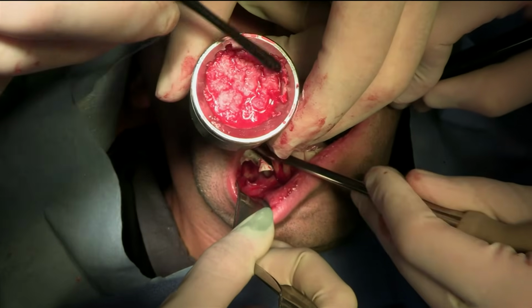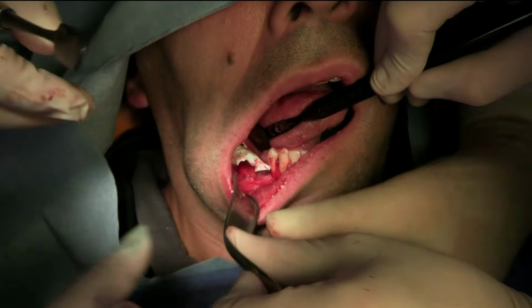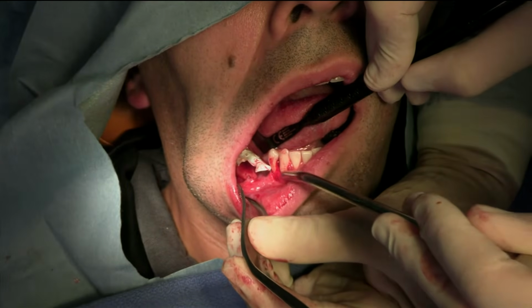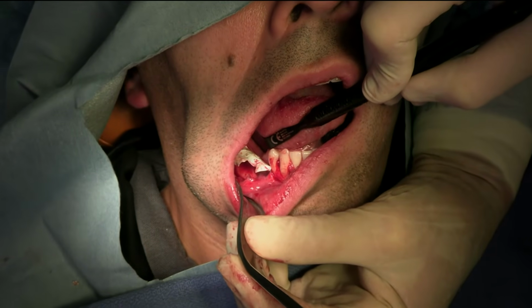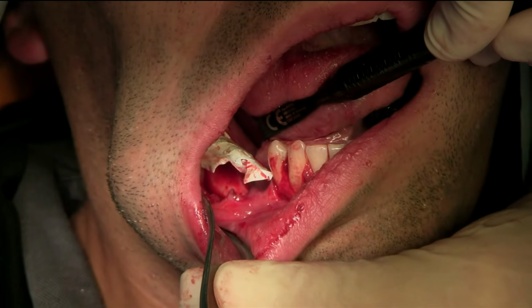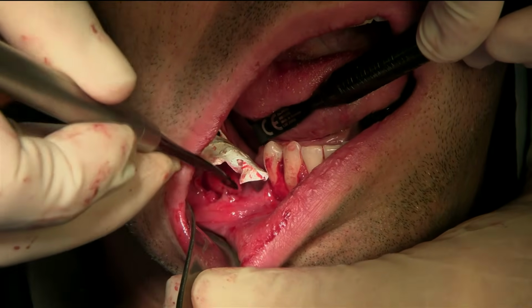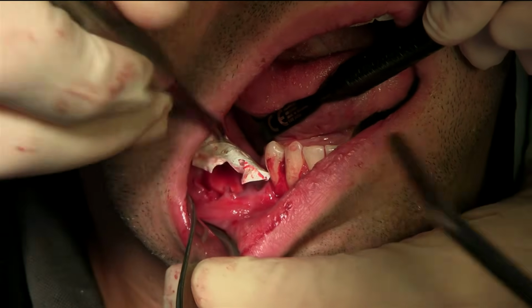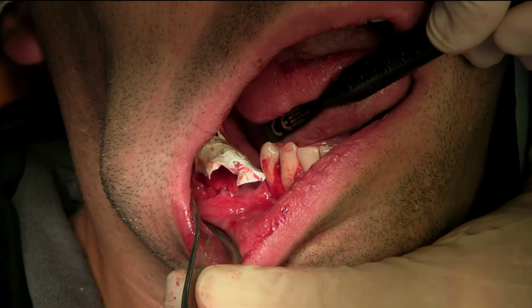Give me maybe another quarter gram of the biomass. Then we have a little bit more volume. So I have a lot of autogenous. So I'll do 0.75 gram of scaffold, so xenograft, and then the rest is all autogenous. 0.25. And then we probably can put a tack here. I put one there, one bone. Okay, we can do a tack here, and then a tack here. Half? Okay.